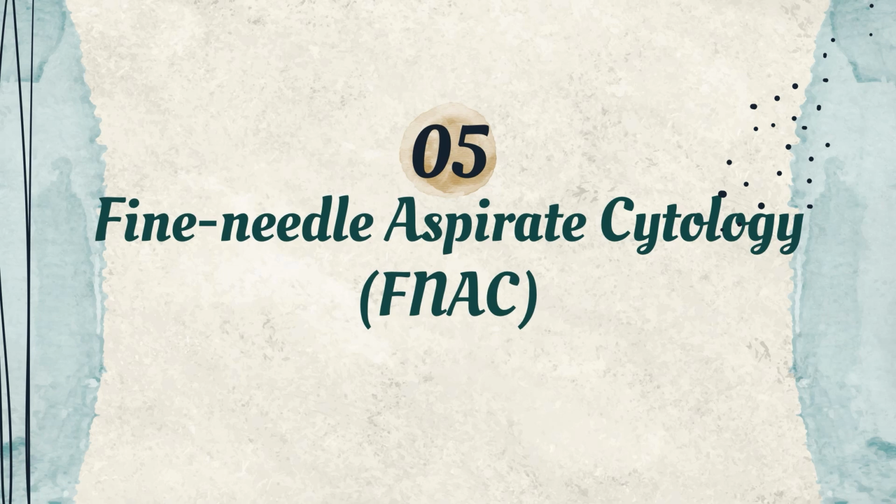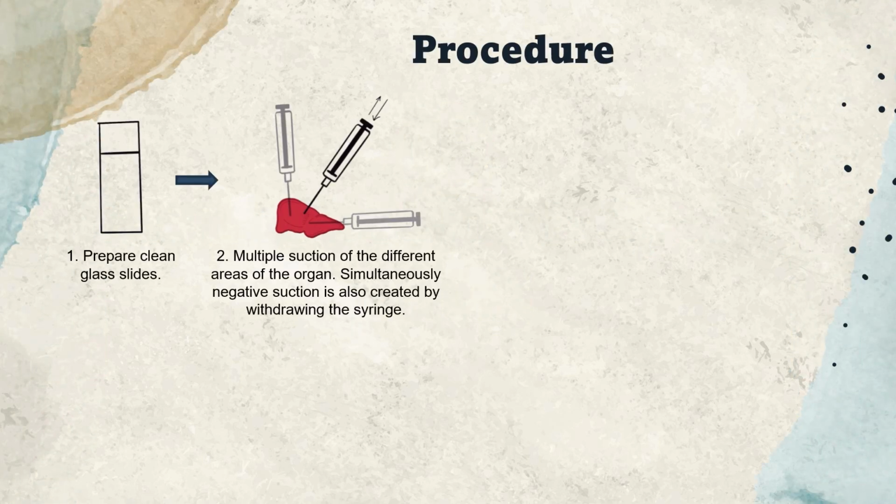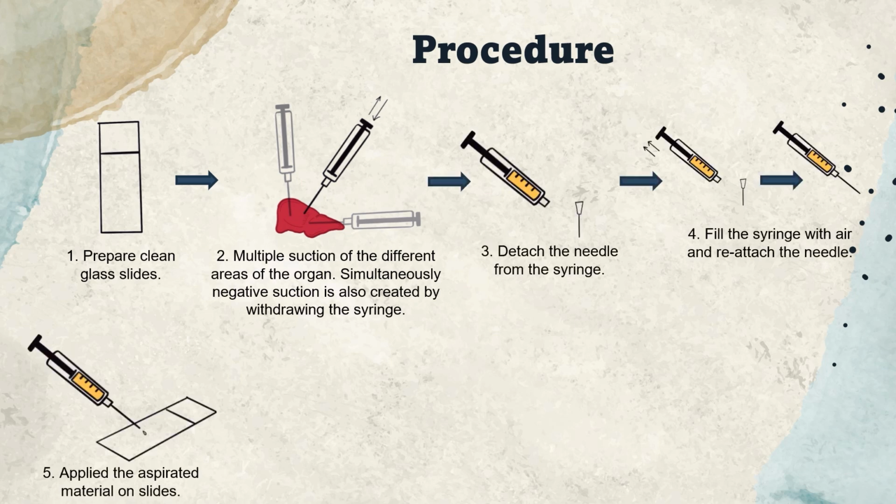Next is fine needle aspirate cytology. These are the procedures for fine needle aspirate cytology, FNAC.